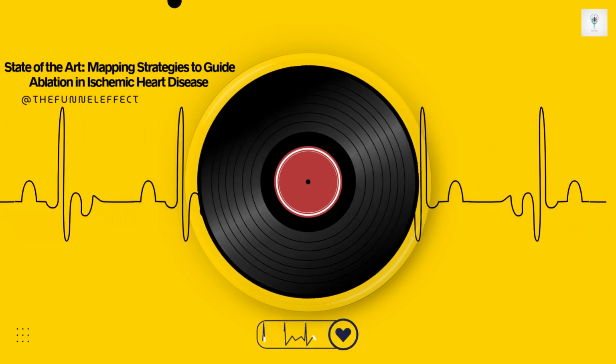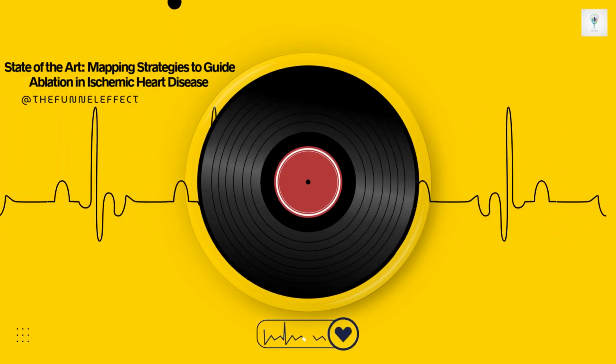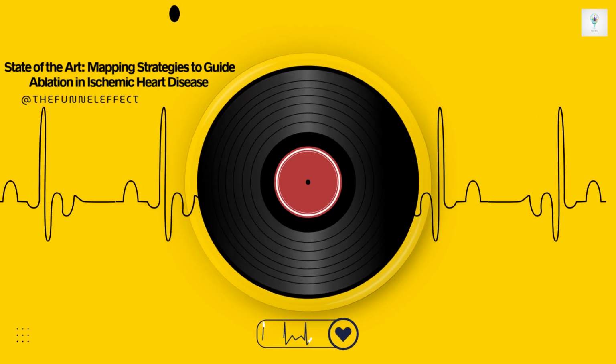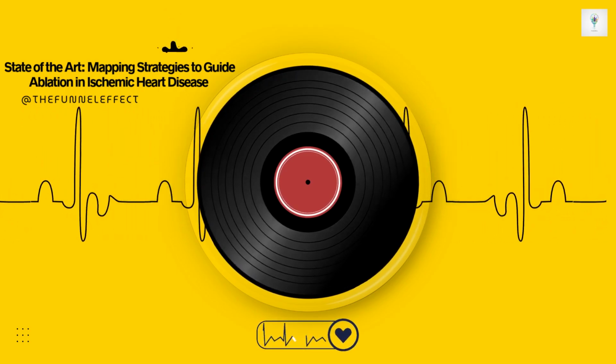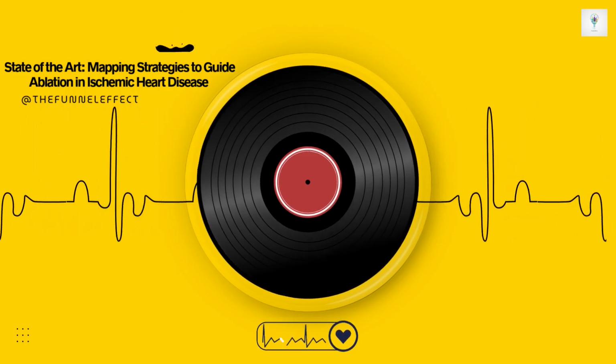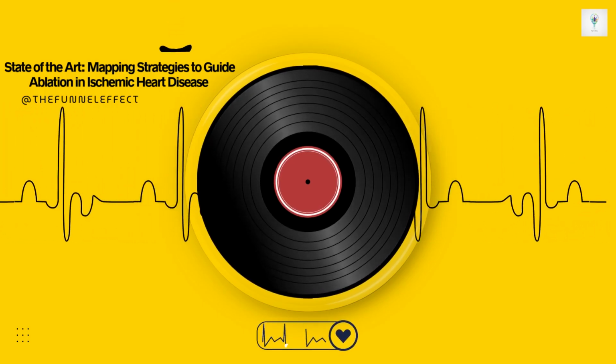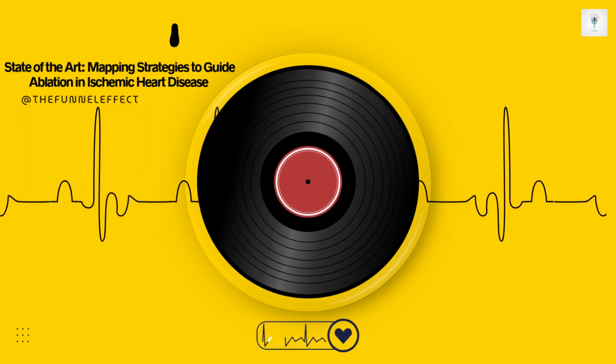If you can't always tell which induced VT is the clinical one, does that mean you have to try and ablate every single one you can induce? Ideally, yes. The data suggests that achieving non-inducibility for all inducible VTs gives the patient the best chance of staying VT-free long-term. That's the goal. But it's not always possible or safe.